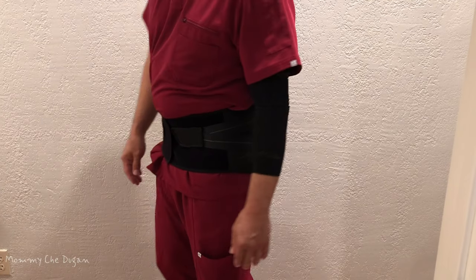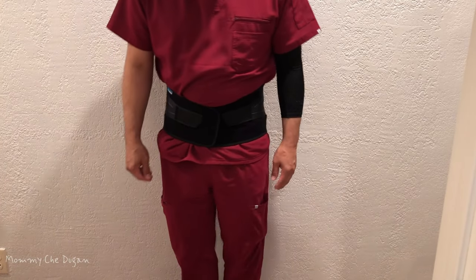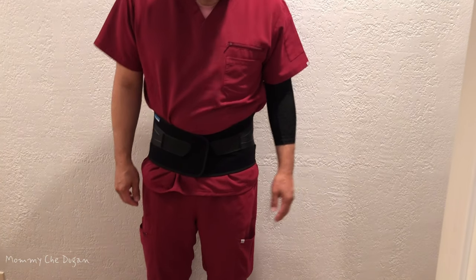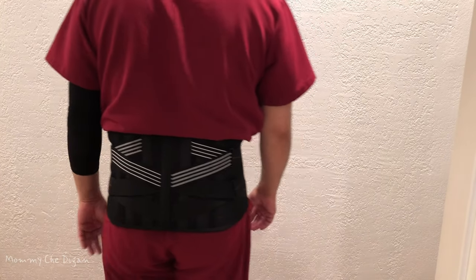Here are the product features of this back brace. This back brace is made from medical grade fabric that ensures maximum comfort during extended wear without chafing or skin irritation.